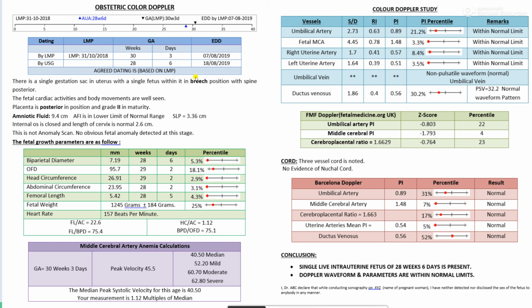Okay, apart from this, it can bring whether it's a cephalic or a breech, placenta anterior or posterior, and its grade, amniotic fluid value, and whether it's oligo or polyhydramnios or in the normal range, or even if it is less than 4 then severe oligo. Those kinds of things it can bring automatically into your report. Even cervix length it can bring.